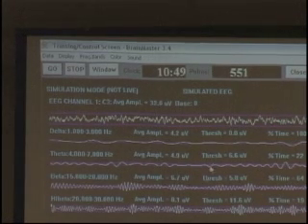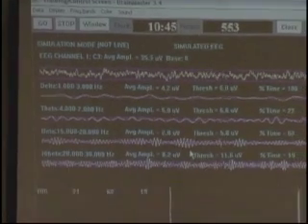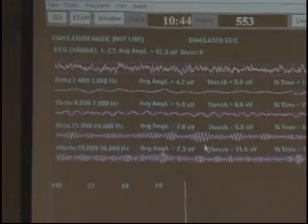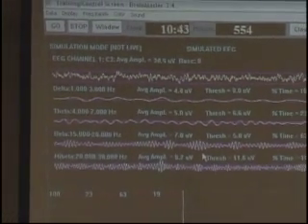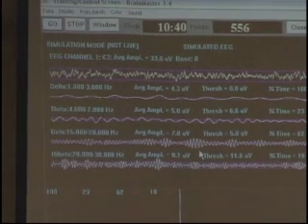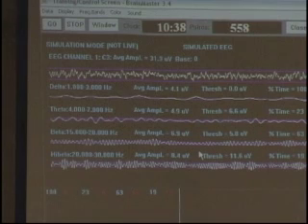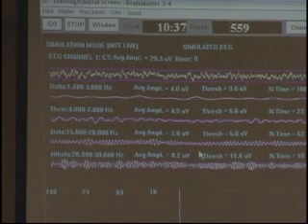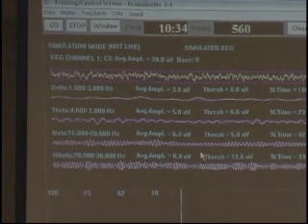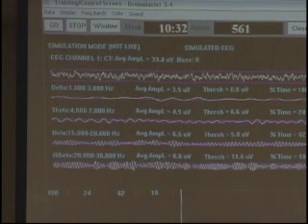Dropping down to Beta — Beta is a 'go' in this protocol. I have two lines here, and our goal is to get the filter wave outside of those two lines. And then High Beta is a stop, so being inside the lines is the goal there.